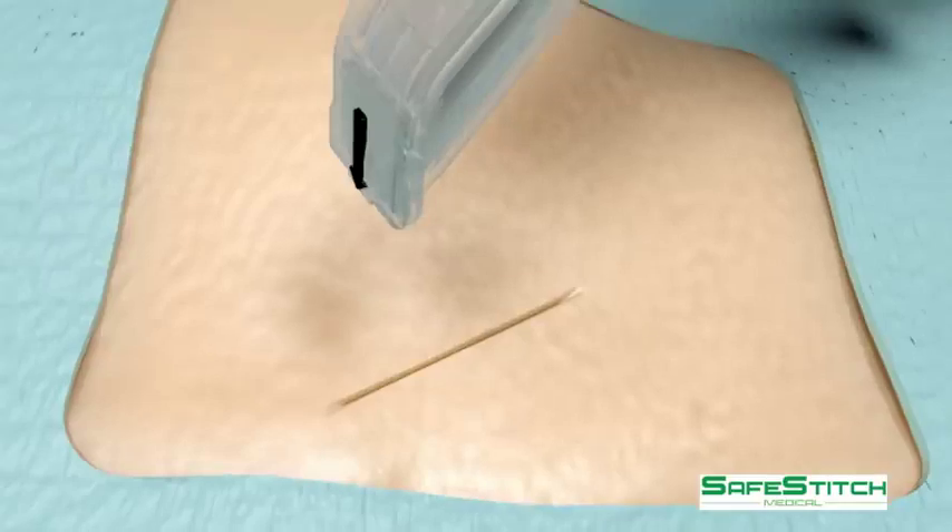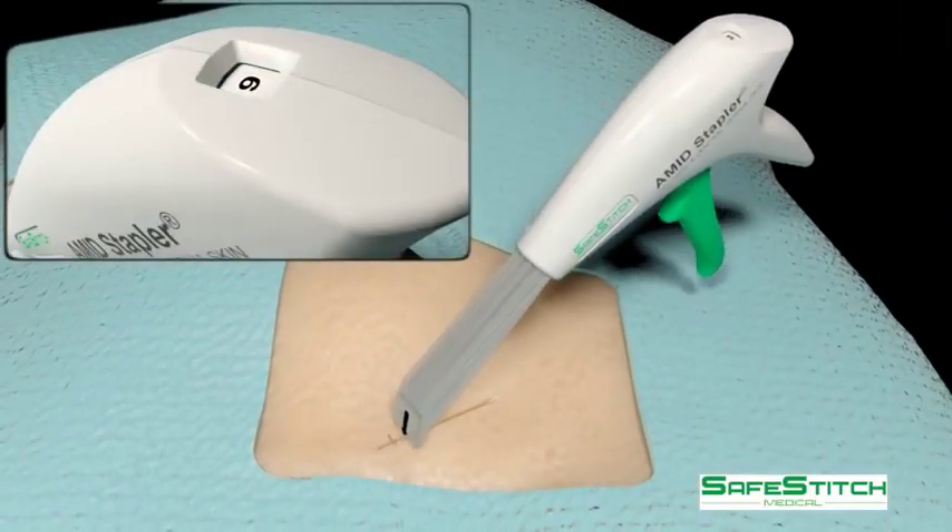The deep tissues are closed with sutures, and the skin can be closed with the stapler.